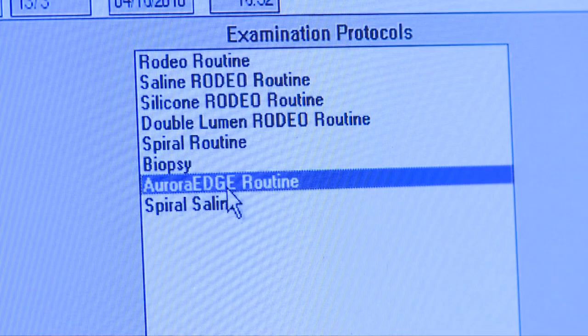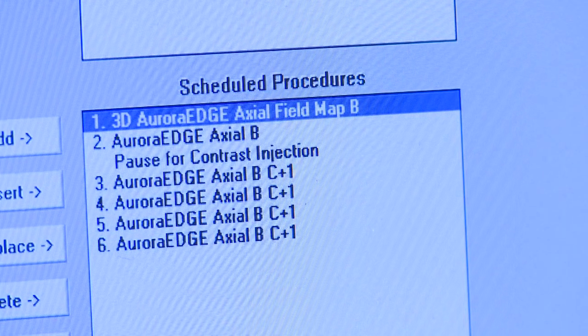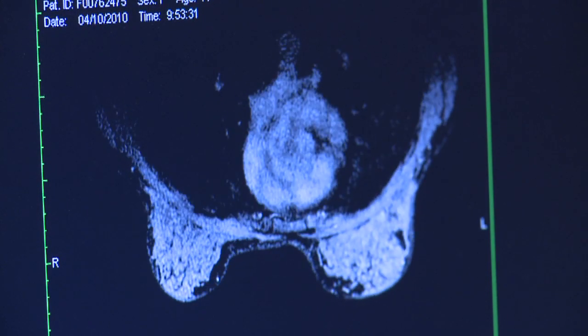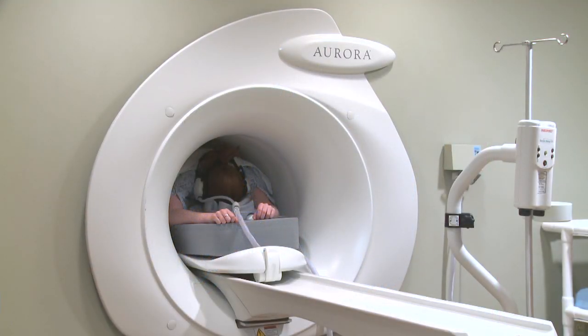Then we define the type of scan that we're doing. We're going to run the EDGE protocol. The EDGE protocol is a 0.7 millimeter slice thickness, and we can get 250 slices. They're very sensitive to motion, so it's very important that the patient holds as still as they can.